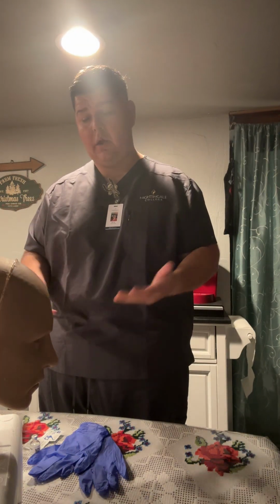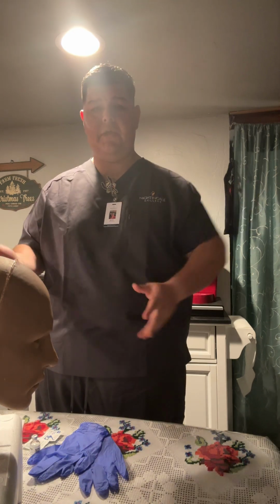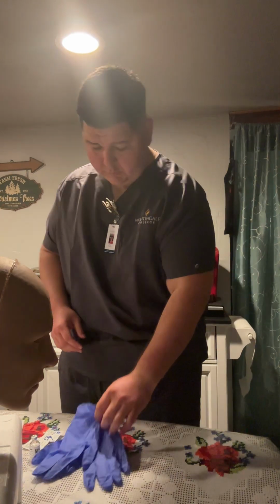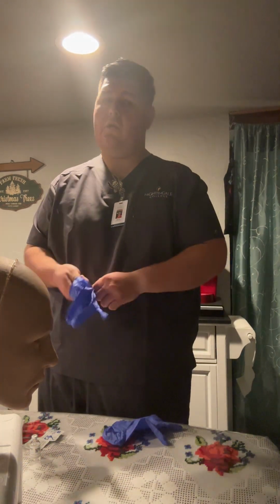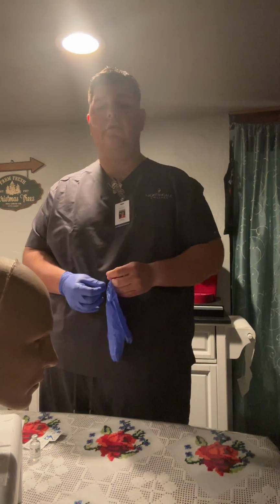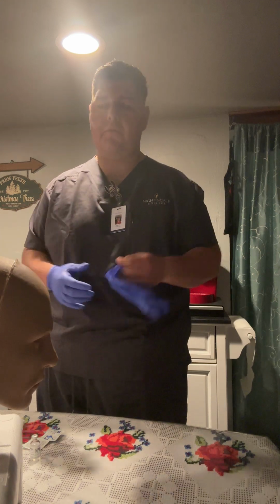Thank you, Mr. Miranda. Are you allergic to anything that we're not aware of? Nope. Thank you. At this point, I can go ahead and proceed in verifying the medication with the MAR. This would be the 2nd verification out of the 3. Once I'm done, I would perform hand hygiene and put on my gloves. Then go ahead and start communicating with my patient. Make sure I'm recording here.